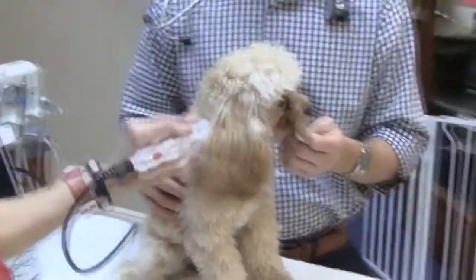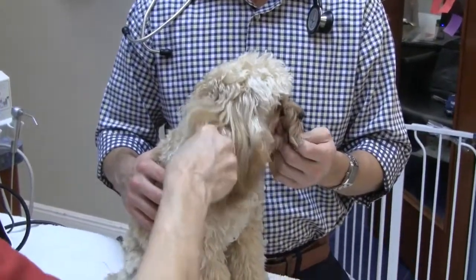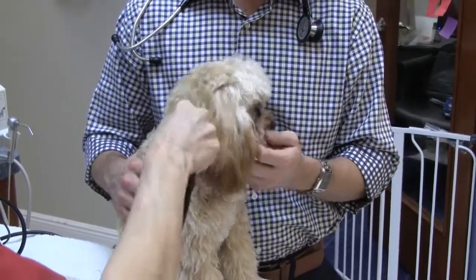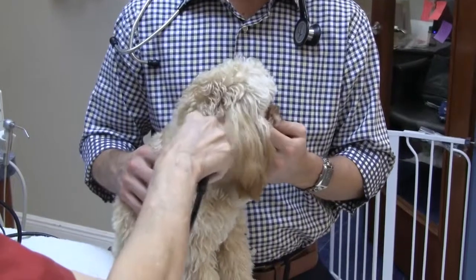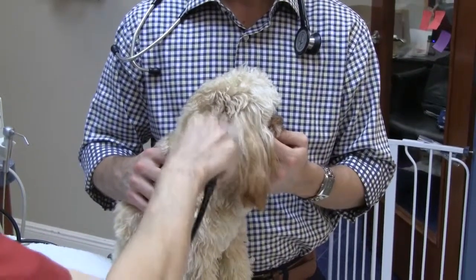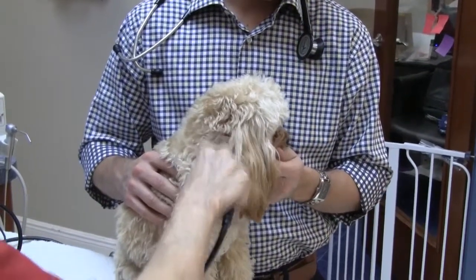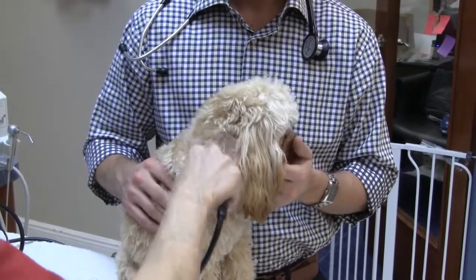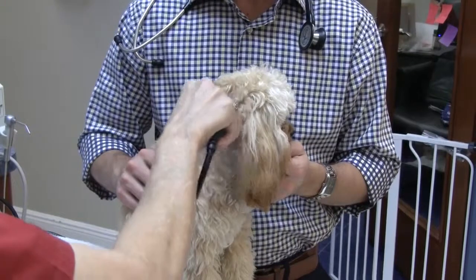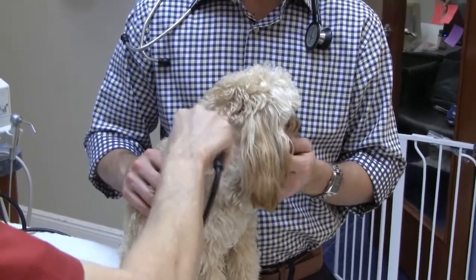The reason I bumped the laser down on her is because she doesn't have the muscle mass that, let's say, a pit bull would have. If I was lasering a pit bull, I would leave it at 10 because there's a lot of muscle to go through. Muscle, fat, she has neither. So that's why I bumped it down. She doesn't need to be at 10 watts because of her weight and size. But like I said, if it was a dog with a lot of muscle or a lot of fat, then sure, I would leave it at 10 to make sure that I penetrated where I wanted to go.